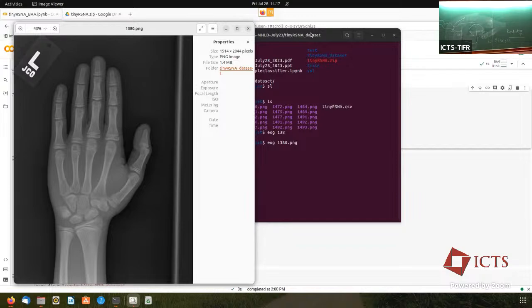What I mean by that is you want to lower the loss until it finds a suitable minima where the generalization is reasonable. So what would you do? Well, first of all, your training error, you want it to come down as much as you can. Okay? But training loss, when I say training loss, it's the loss on the training data set.